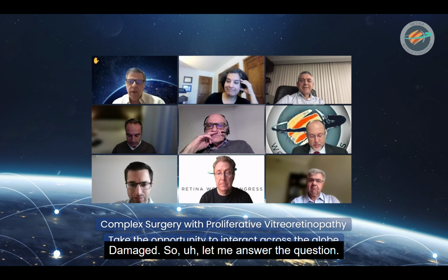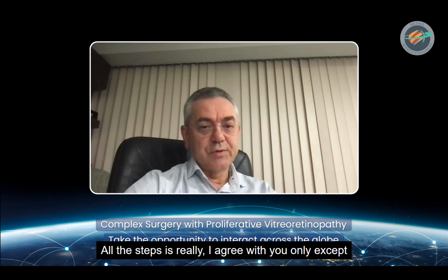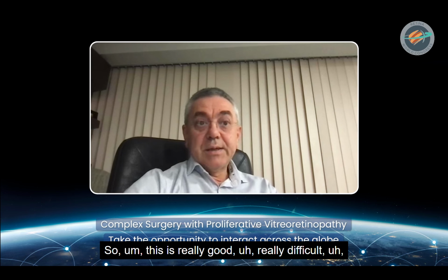So let me answer the question. So this is really a great case. You did a very great job. All the steps, I agree with you, only except that I apply direct silicone oil PFO exchange instead of fluid-air exchange, because this is another technique, but it's also an easy way to apply the silicone oil PFO exchange directly without fluid PFO exchange. So this is really good.